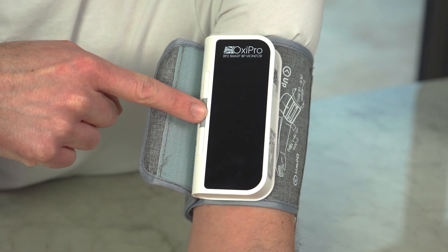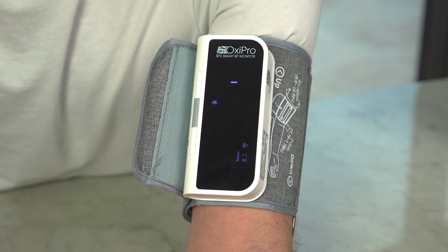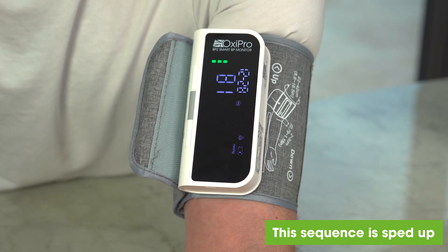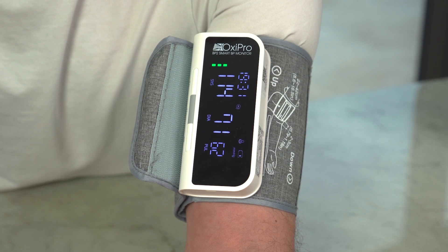Sit at a table with your arm supported and the blood pressure monitor at the same height as your heart. To start a test, press and hold the middle button until the screen lights up, then release it. Important: do not move or talk for the duration of the test. The cuff will inflate slowly, then deflate slowly, after which your result will be displayed on screen.